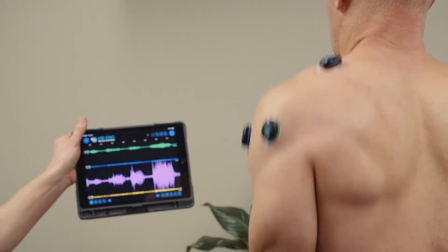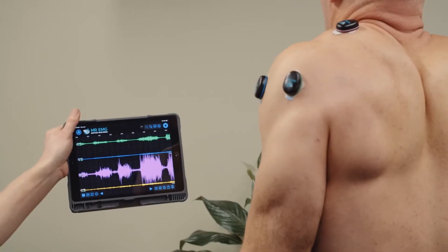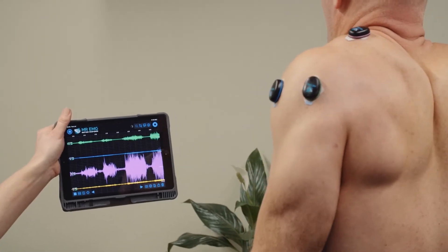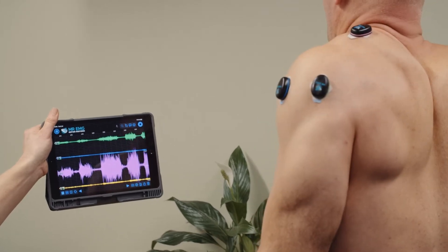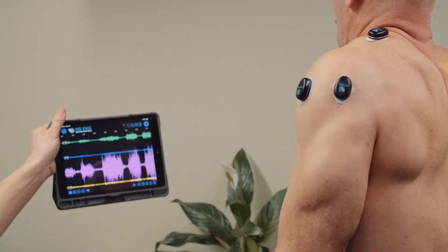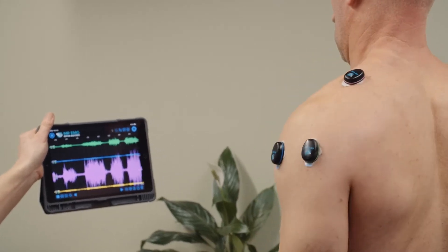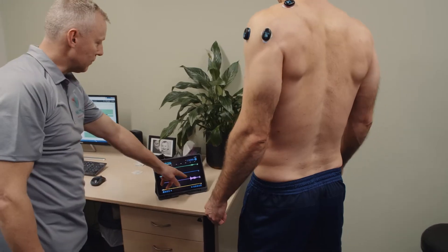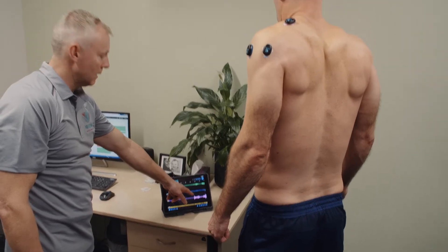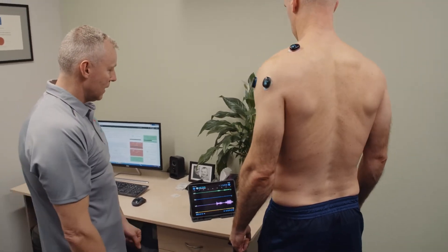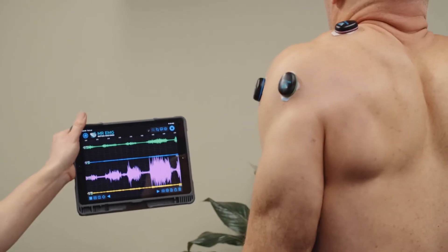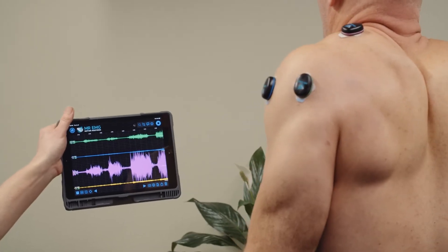Now show your subject how to perform a maximal voluntary contraction of the upper trapezius using Mr EMG biofeedback. Now record your subject performing three maximal voluntary contractions of the upper trapezius simultaneously.